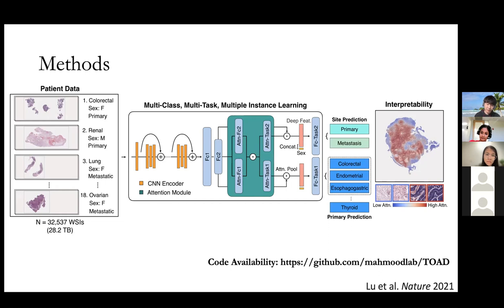So it's likely assigning very high attention scores to a few locations in the slide and ignoring the others. In that case, even though technically there is a gradient signal for every patch, those gradients are pretty much zero, so it's not necessarily learning from the other regions in the slide anymore. I'm not sure if this is totally the right way to think about it, but one scenario where this phenomenon would be insufficient is, let's say you have a single class. You might have different types of morphology that are characteristic of that class.